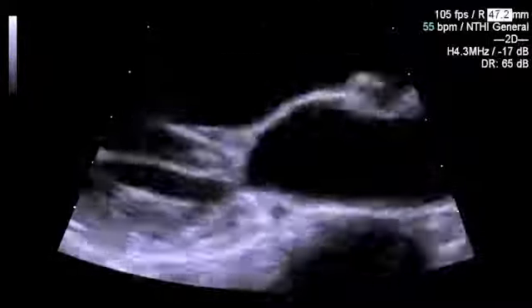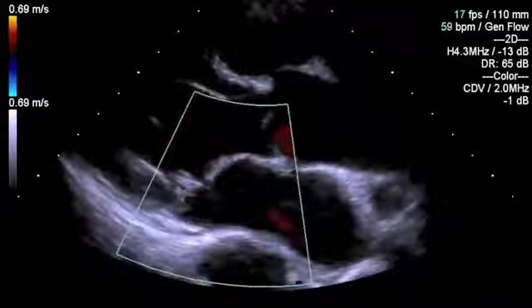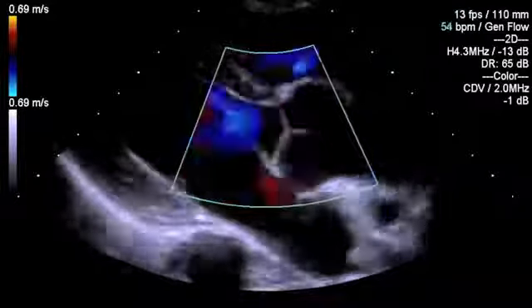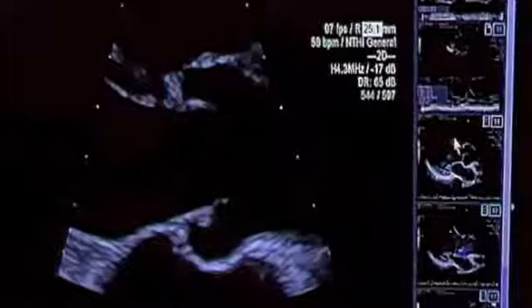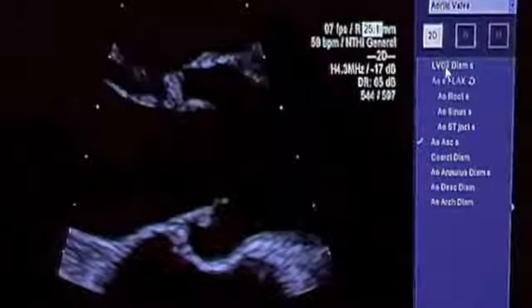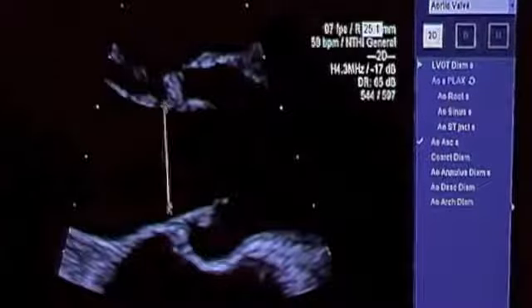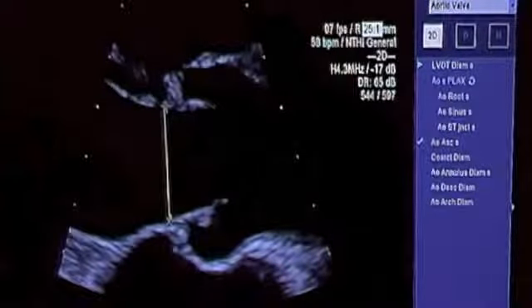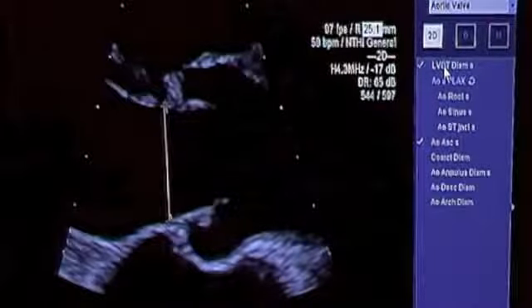Make an assessment of the mitral valve and the aortic valve, looking at the morphology, leaflet movements, and apply colour flow Doppler to assess for any gross valvular regurgitation. When zooming in on the left ventricular outflow tract, make an assessment of the size by measuring at leaflet insertion or 1 centimetre proximal to leaflet insertion, the distance at its widest point, which is usually in early systole.